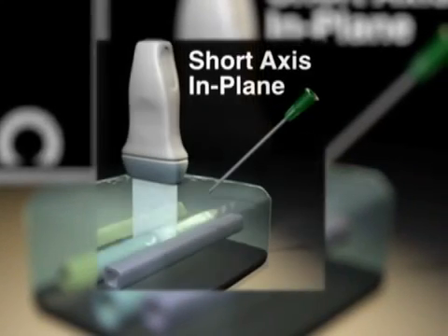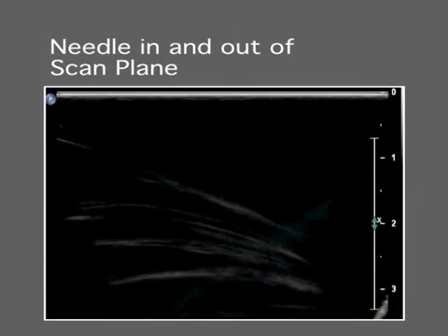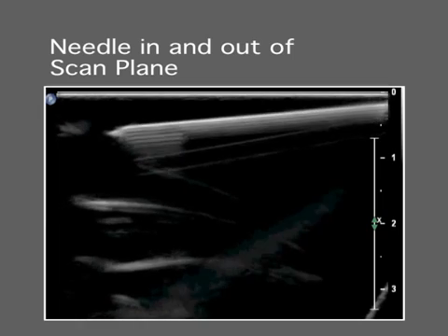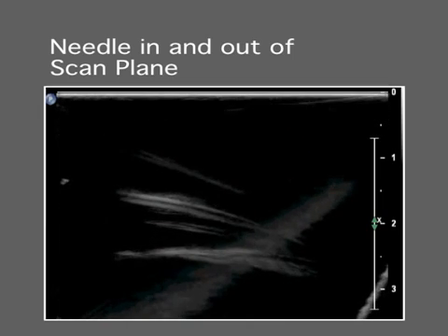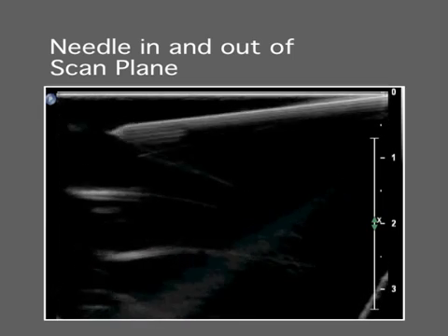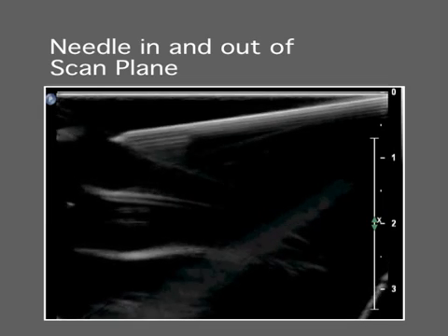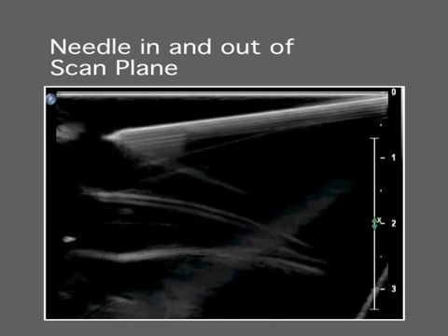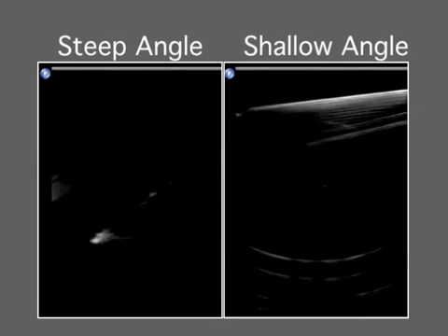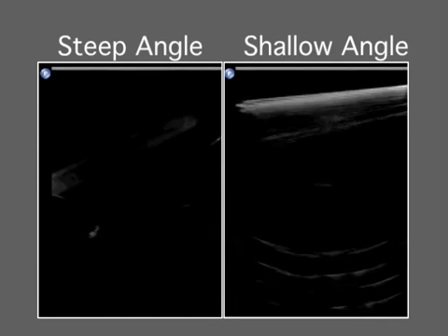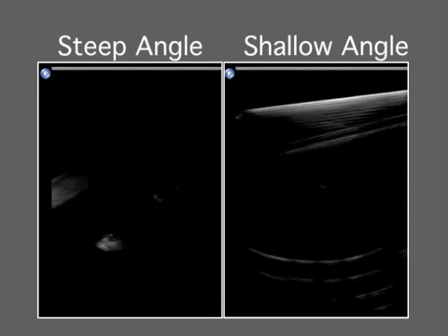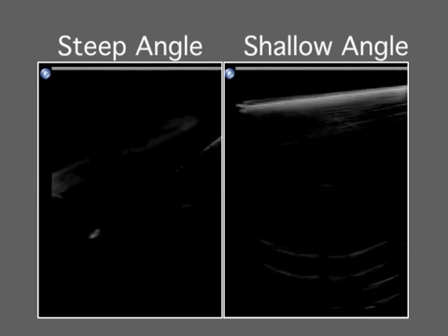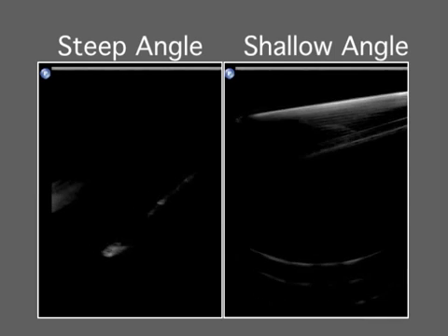In-plane needle manipulation offers its own set of challenges. Here is a sonogram of a block needle with the transducer sliding in and out of alignment with the needle. Subtle movements of the needle or transducer can produce marked changes in visibility. This pair of sonograms shows the same needle at different angles in a water tank. The needle is much better resolved when it is inserted at a shallow angle relative to the transducer.